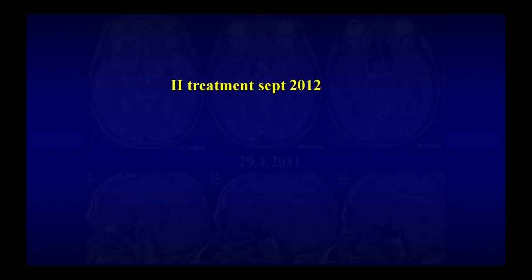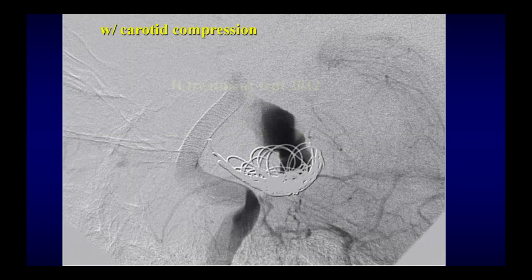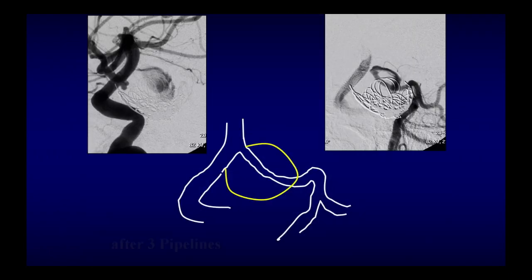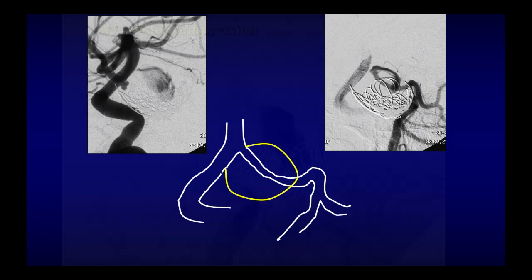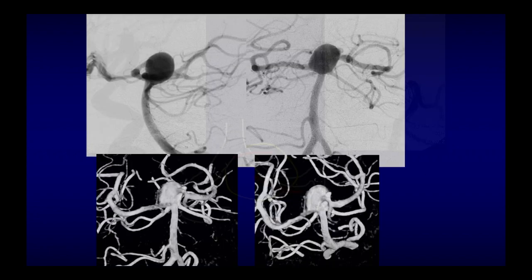I just want to go to the conclusions of this thinking. You remember, this is what we thought: that the presence of the communicating artery gives you flows which are counterbalancing one another. One goes in one direction, the other one goes in the other direction, and so the aneurysm is still continuously kept open by the fact that the thrombus cannot stabilize. It's always in continuous motion, it's living. And by being unstable, it will grow progressively.